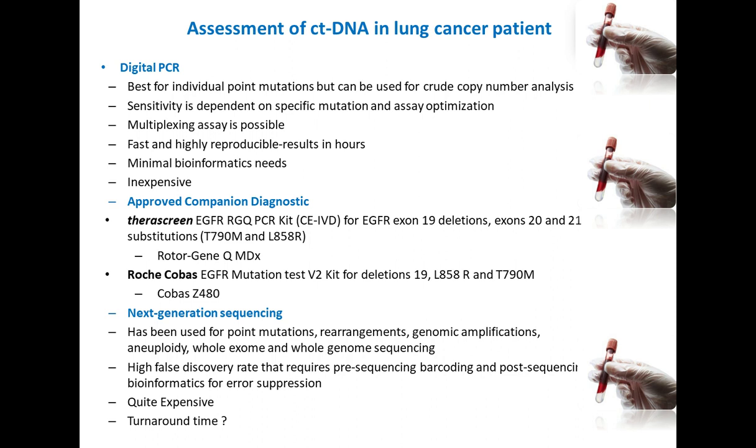So the assessment of circulating tumor DNA in lung cancer patients can be made using different technologies showing various sensitivities, but also different specificities. For example, the droplet digital PCR method, which is best for individual point mutation detection and which needs a minimal bioinformatics development in the lab.